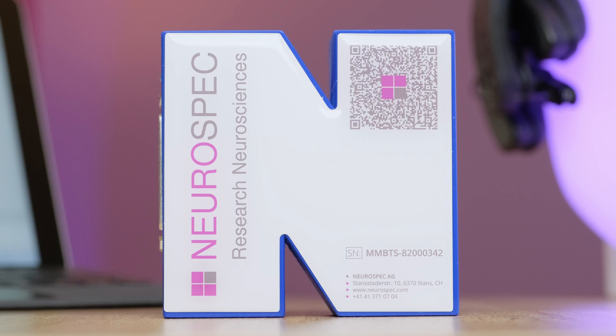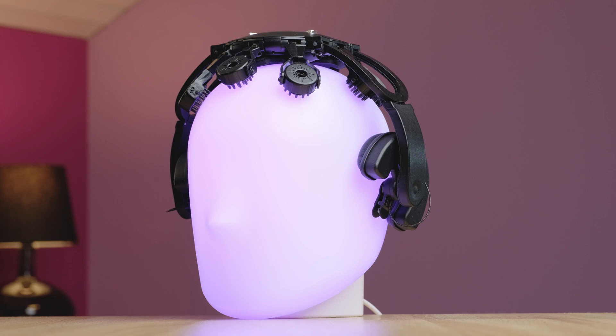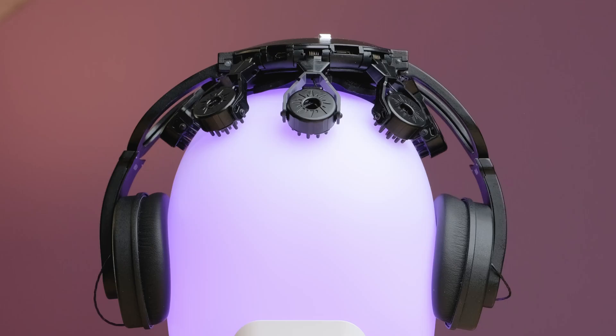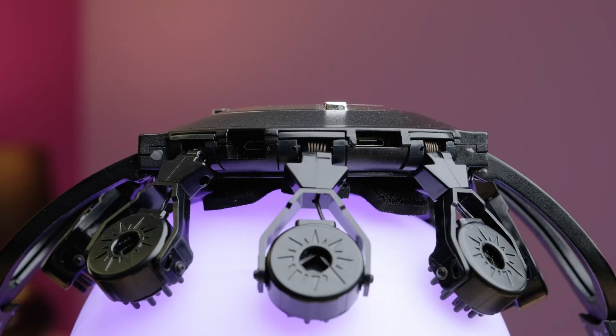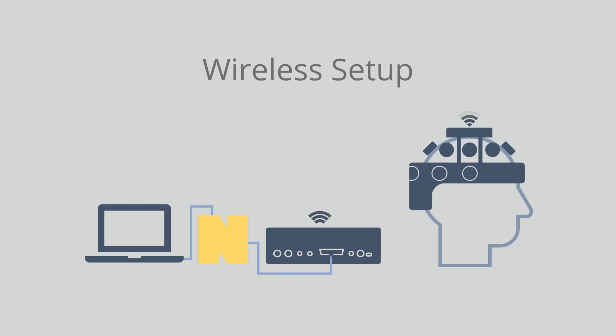Here in front of me we have the MBTS, and to my left the DSi-7 from Wearable Sensing. The DSi's trigger input port is located on the back of the top part of the DSi. There are two different ways we can send triggers to the DSi — either in a wired or wireless fashion — and we'll be showing you both in today's video.